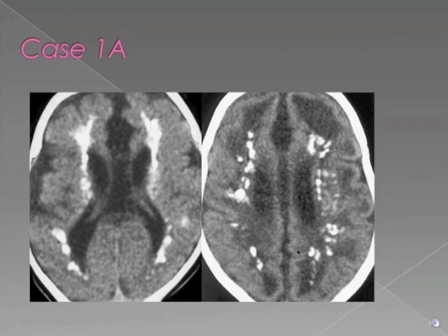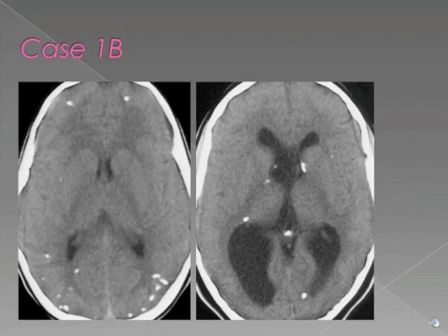Case 1a: We have two axial CT images through the lateral ventricles which demonstrate extensive periventricular calcifications which are more or less symmetric in distribution. Case 1b is a companion case which also demonstrates periventricular calcifications. Note that these calcifications are not nearly as extensive nor as symmetric as in the preceding case. In addition, there are calcifications elsewhere in the brain including within the basal ganglia and at the gray-white junction.